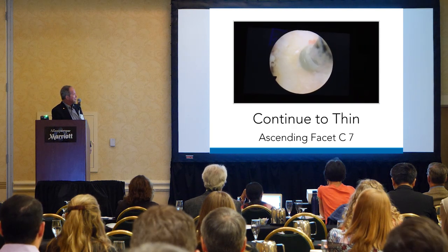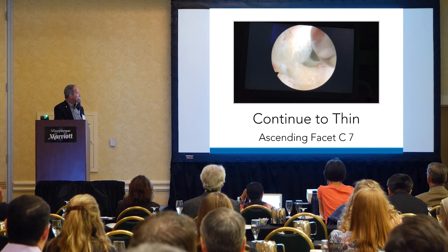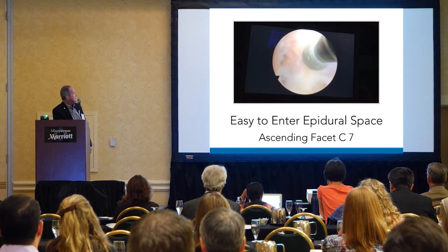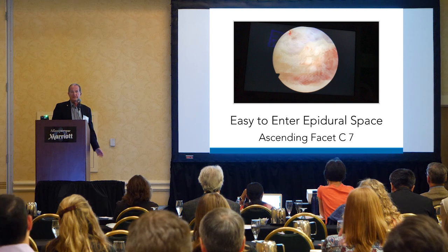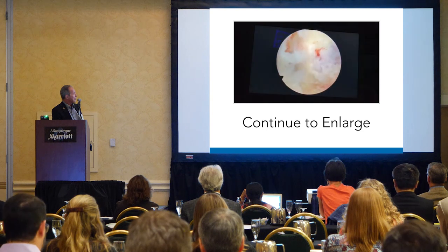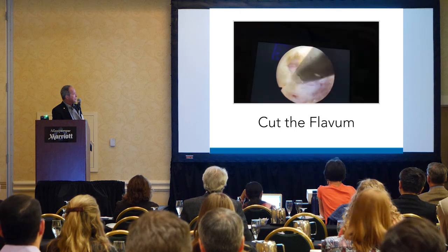Here's more of the diamond burr. We're just thinning out the caudal lamina of 7, and we're moving here lateral. There's the facet joint right there to the left. This is the ascending facet of 7. You're going to see it here in the epidural space, but again, with the diamond tip, it doesn't grab or cut anything. It's just leaving it very thin, because the next thing we're going to do is use the Kerrisons to remove this thin layer. So the idea, particularly on the caudal lamina and ascending facet, is to thin it out as much as we can before we switch over and open the interlaminar space and then cut away the bone.